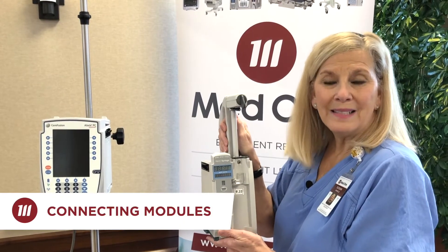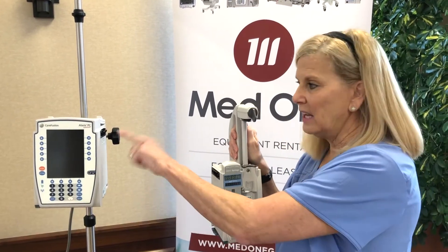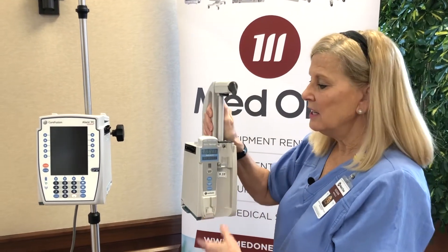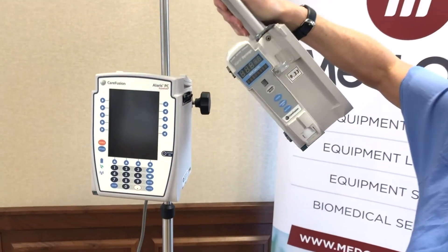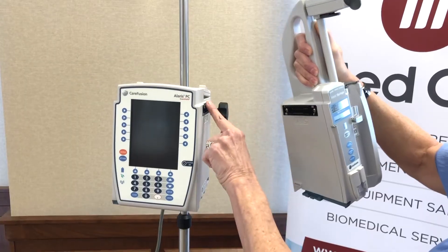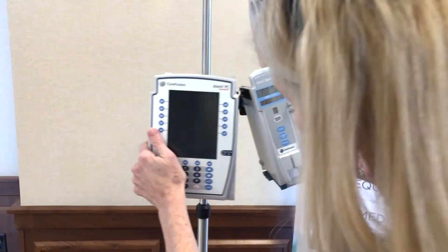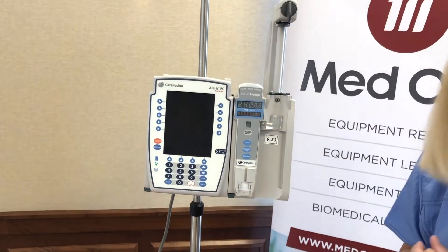Now we're going to attach the syringe pump module to the point-of-care unit via the IUI connectors. You want to take the syringe pump module tilted at a 45 degree angle, lining up the groove with the actual IUI connector, then seat it in there — you'll hear a click when you have reached communication.